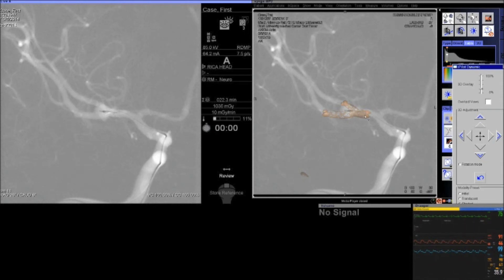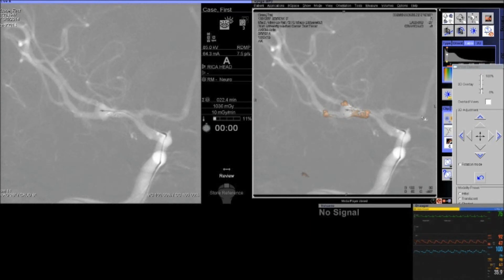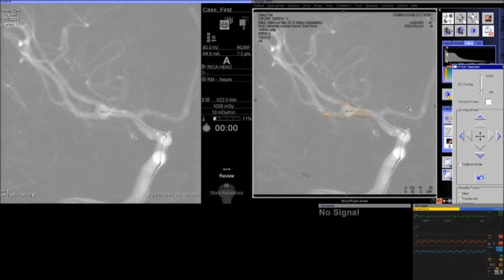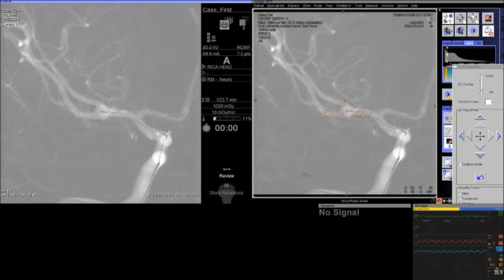One can argue that it would be acceptable to place the microcatheter in parallel, but it gets quite busy when constructing a Y and positioning a microcatheter into the aneurysm — especially for small aneurysms like this one. The overlay technique gives you a clear idea of where the transition between the parent vessel created by the Y-construct and the aneurysm is. We have to place very little wire in the aneurysm because this is a multi-lobe aneurysm — the daughter sacs are extremely high risk for possible rupture — so one has to fade the overlay in and out to visualize both the device and the boundaries of this complex anatomy.